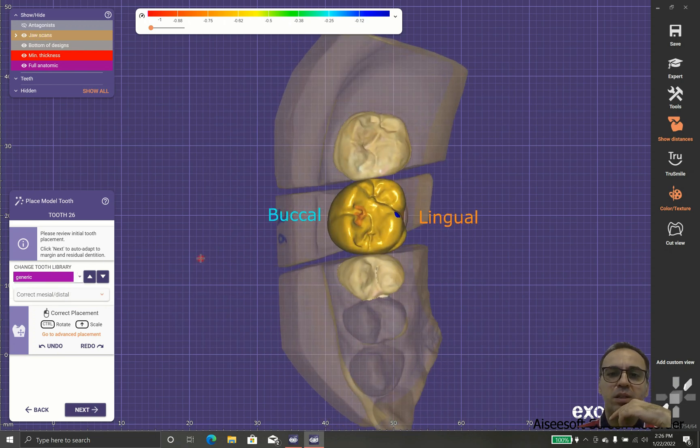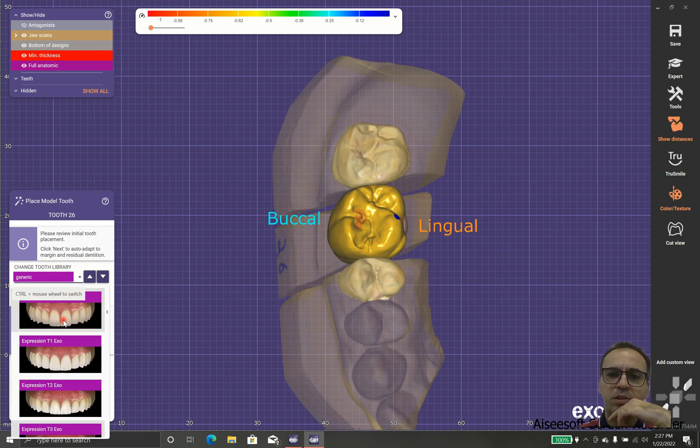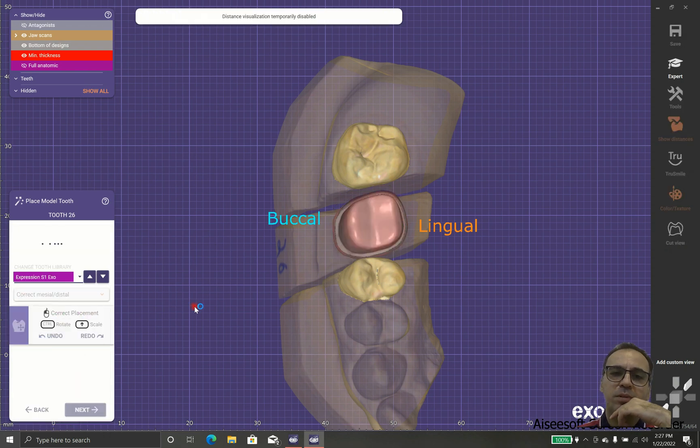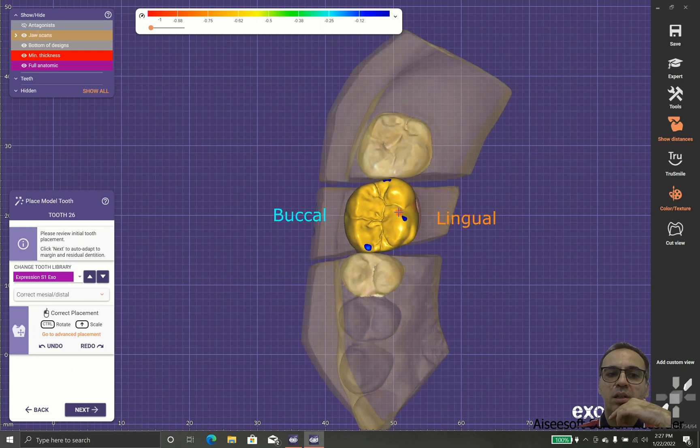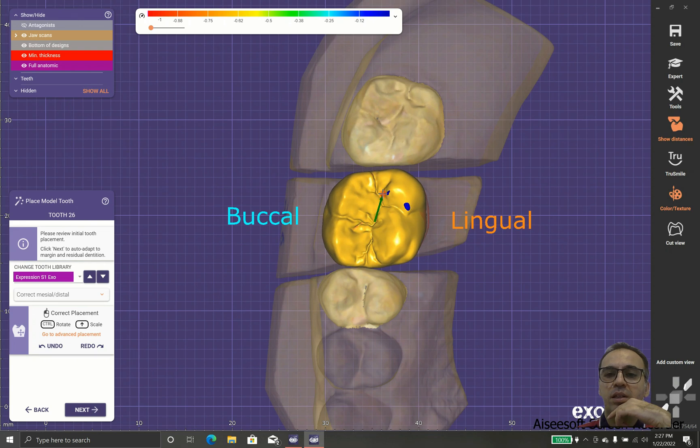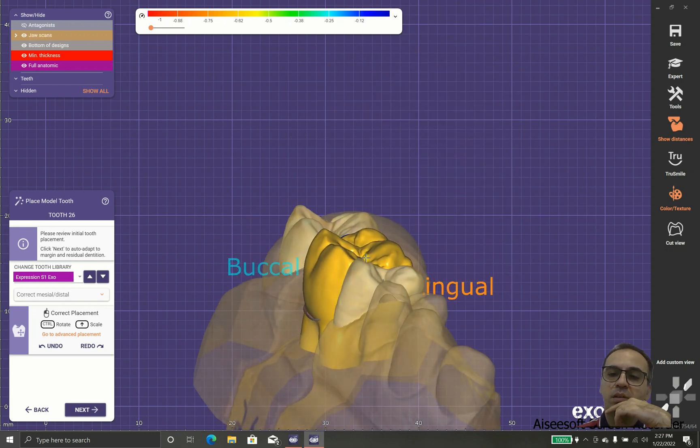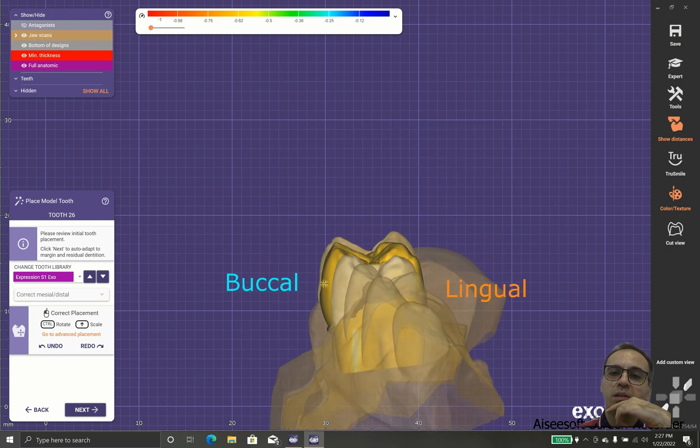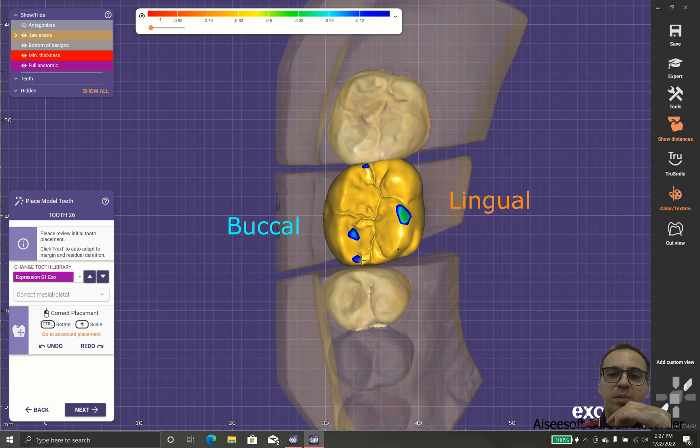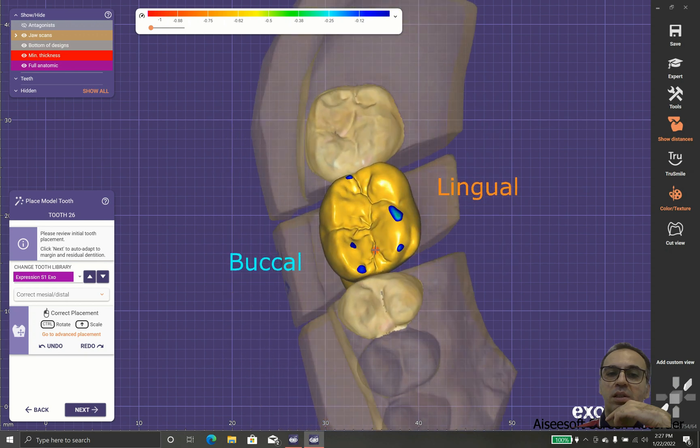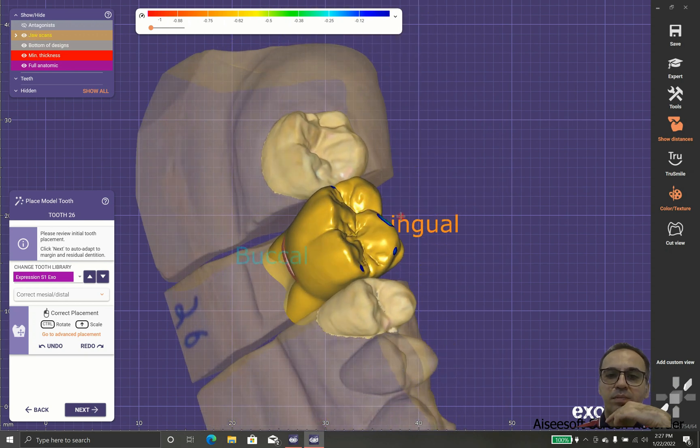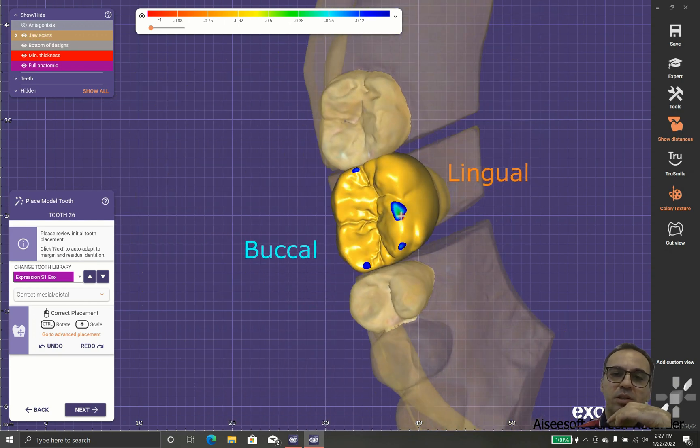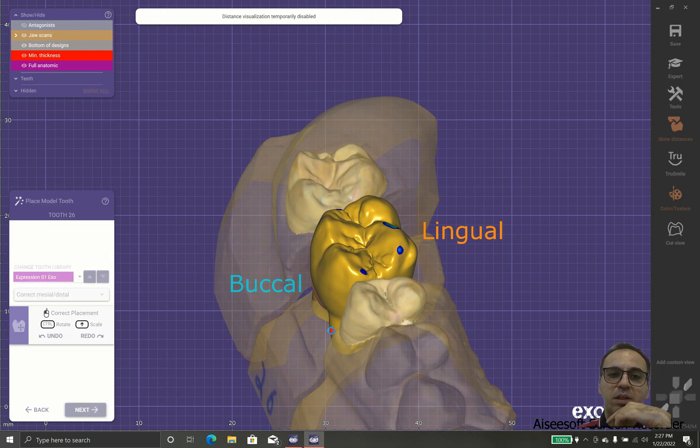In this part the software lets us choose the library. The library means what's the shape of the teeth that is going to be replaced. Generic is one of the best libraries because it's so scalable. When you transform it or resize it, this shape doesn't get ugly. But sometimes we need shapes other than generic, like this case, Express One, which is one of the shapes that looks so good and fits our design.